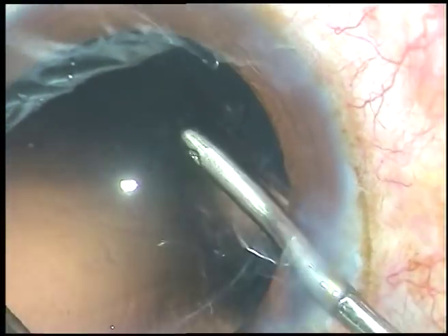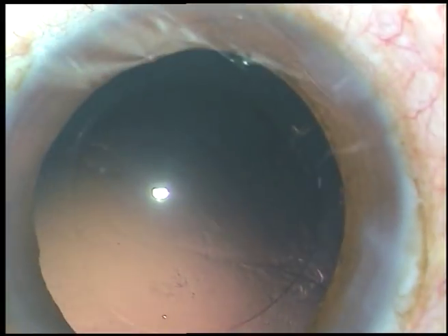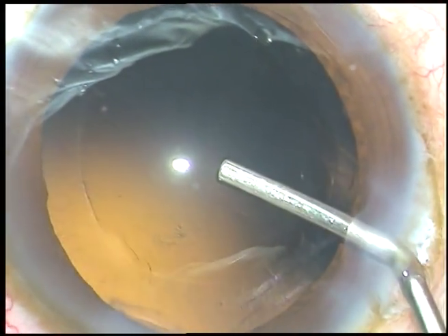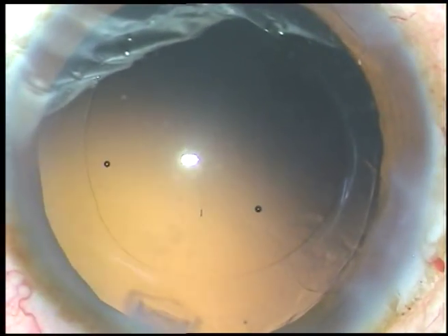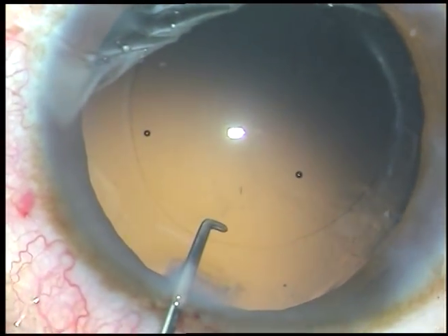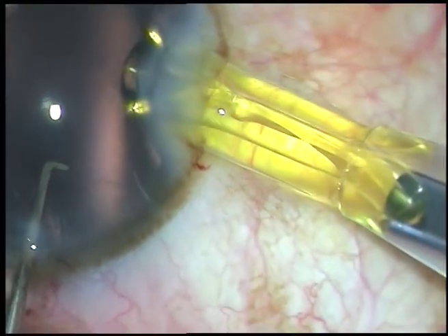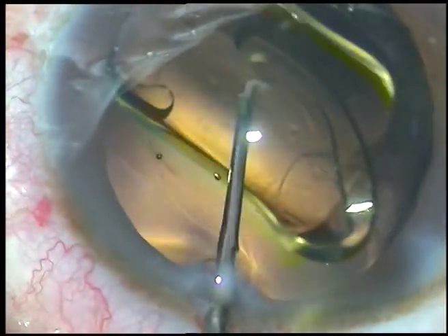I do some hydro polish — with the irrigating jet of fluid, cells sticking to the posterior capsule are dislodged. Now viscoelastic substance is used to fill up the anterior chamber and the capsular bag. In this case we have selected the Acrysof IQ as the intraocular lens because the patient wanted it — the patient has an Acrysof IQ in the other eye.